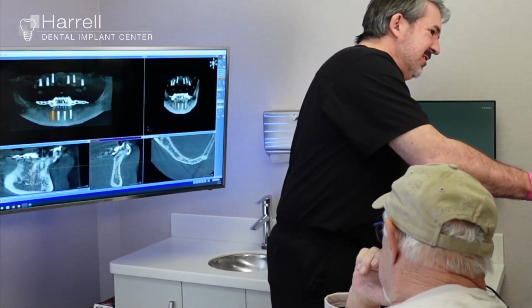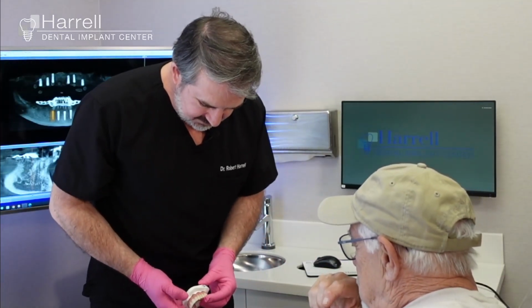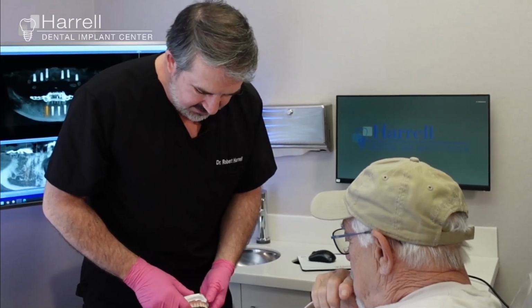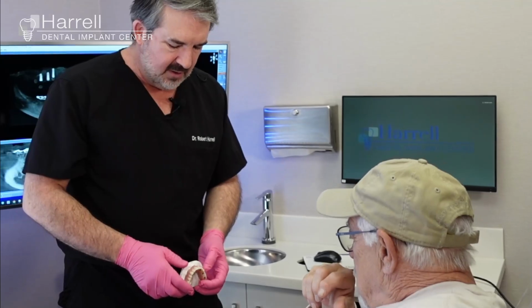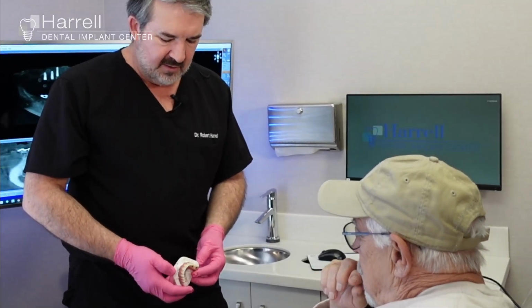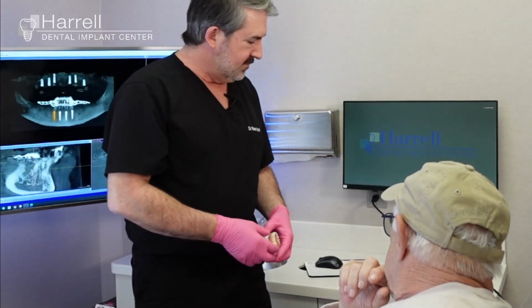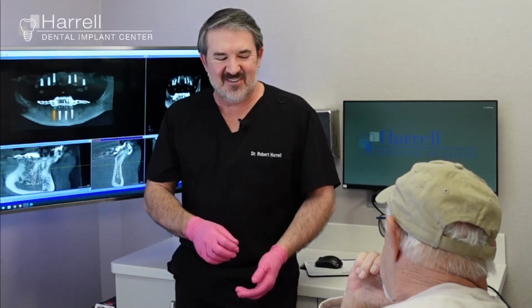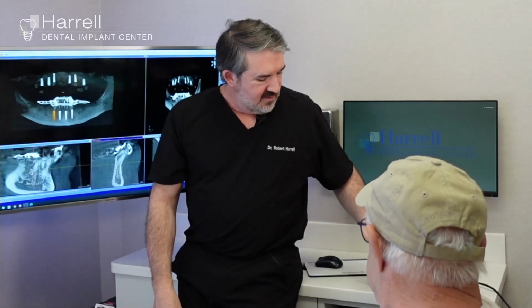What do you got? Provisional set? Yes. Yeah, so here's a provisional set. And you can see the holes are a little bit larger for access during this set, but that's all made from a printed material. And then the gum color is hand applied, finished. So they look real natural. Yeah, they do, and that's a huge difference in those two gums. Well, sorry, I didn't mean to scare you with that first one. I was just having a hard time visualizing, you know what I mean? Yeah.